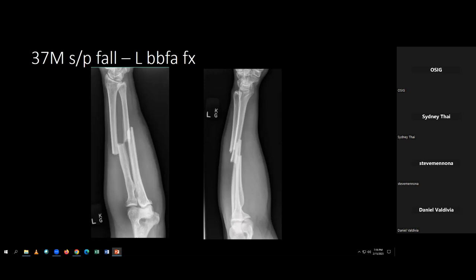So they sort of rotate the arm somehow. Sometimes patients are really painful, so the injury films are not awesome, but they basically try to rotate the arm. It should be like this, where your arm is above on a table and your elbow is curved like this and your thumb's pointing up, but that's usually not the case when someone's injured and screaming at the x-ray tech.